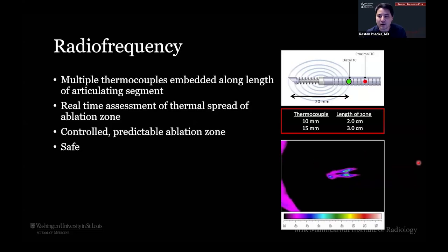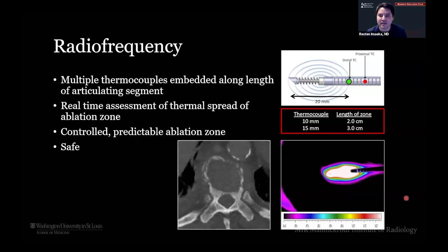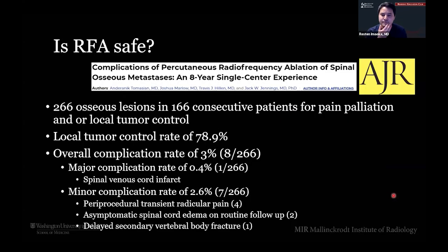And another reason why RFA is so safe in the spine is because it's impedance based. Things like an intact cortex are very resistant to the energy spread, and therefore the energy does not traverse it, right? So this is, of course, more difficult in patients where their cortex is destroyed, right? You got somebody like this where they've got all these holes in their cortex, or worse, if they have no cortex back here close to the spine. In those cases, you're going to have to be a little bit more careful, potentially employ some thermoprotective techniques, which we'll talk about later on.